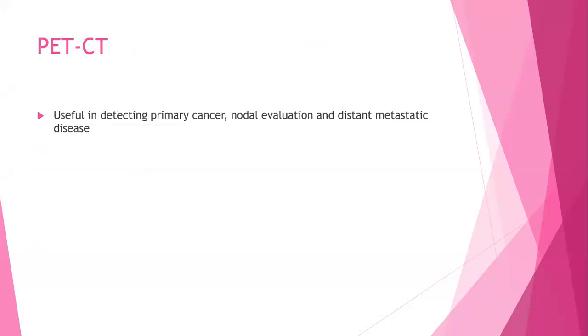So PET-CT is also another useful modality when you have a patient who's had a breast cancer diagnosis. It can show the detail to greater detail because you're looking at the FDG-avid areas of increased metabolism within these masses. It is also important in looking at nodes and assessing for distant metastatic disease.